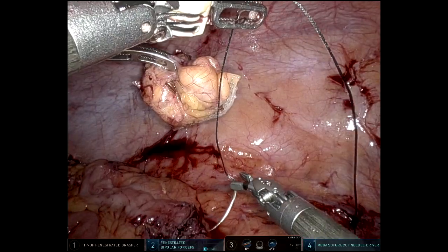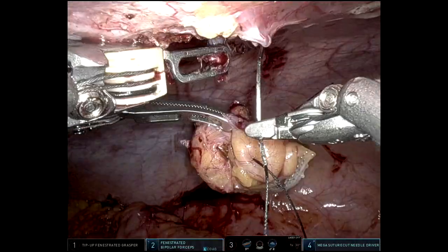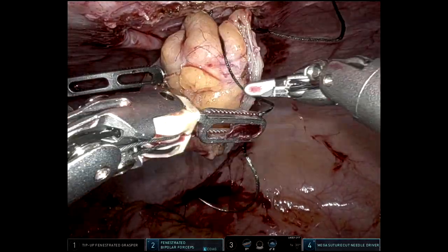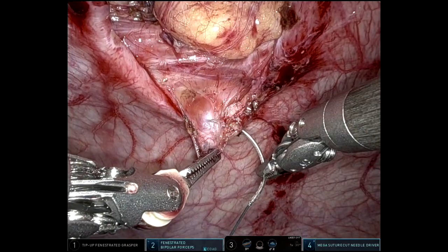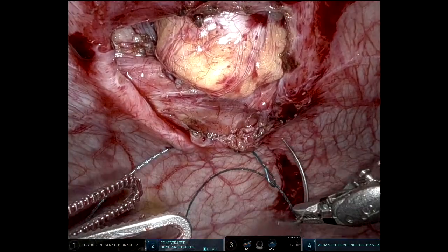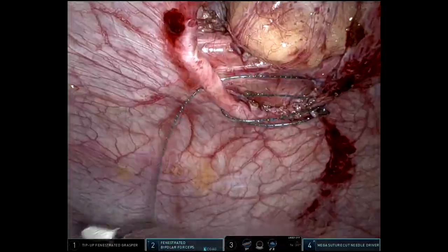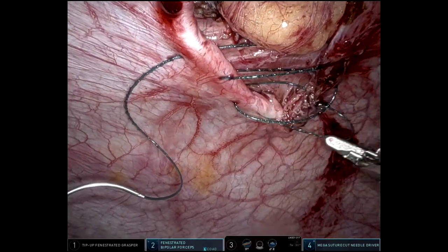I do have an assistant at the bedside, but she doesn't go from below to do the stapler or anything like that — so that's me as well. Here's a little trick: I'm sewing the additional specimen to the colostomy so that when I finally cut out the colostomy at the end of the case, it'll just come with it. She had a pretty nice posterior rectus sheath, so I thought it would be good to do the posterior closure robotically, and then after removing the colostomy, close the anterior fascia as well. That went pretty well.